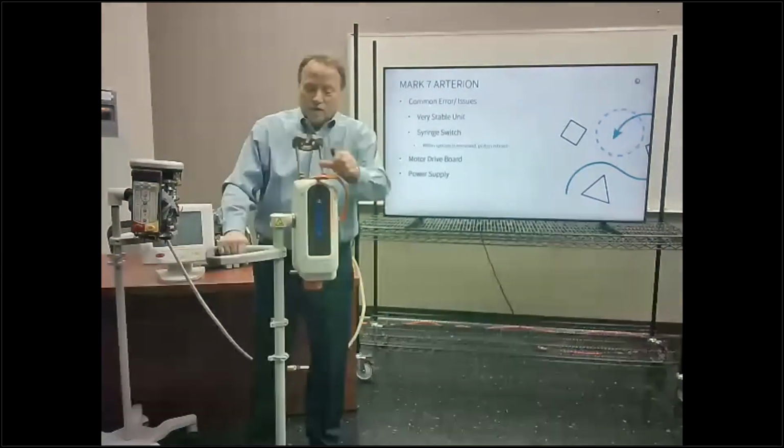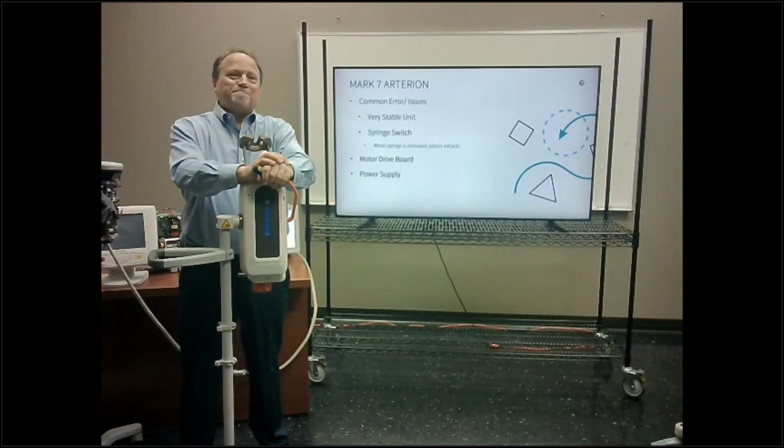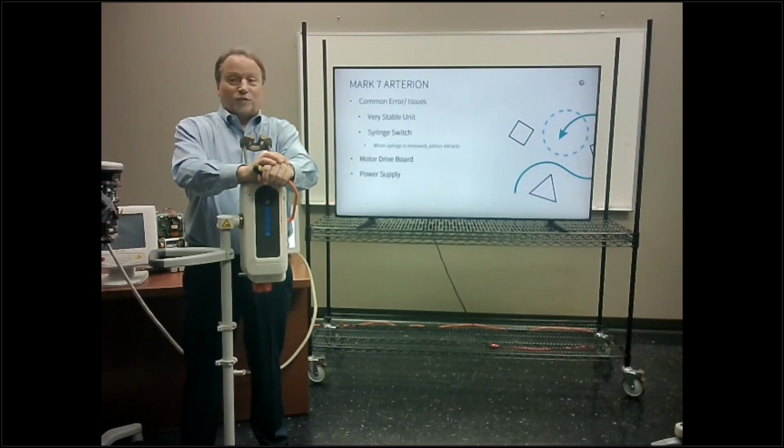Power supply. Power supply is unique. It's in the power module, and in the power supply it has what they call a variable power supply. Now that can mean different things to different people. But what it actually means is it'll take 110 to 240 input off the standard plug, and it automatically converts whatever power is given into the power that the injector needs. It does that through modules. And when one module goes out, nothing happens. It's a protective circuit in there.